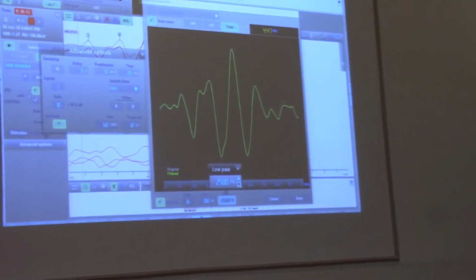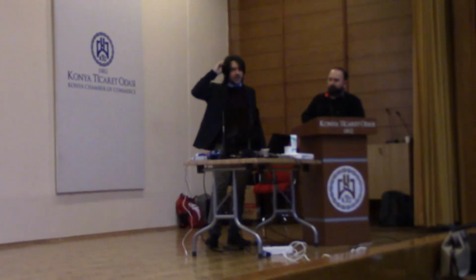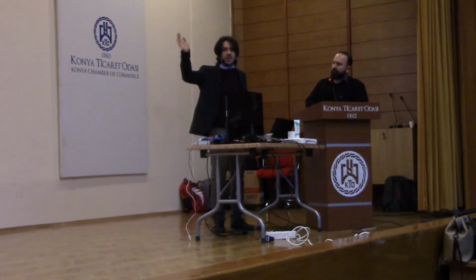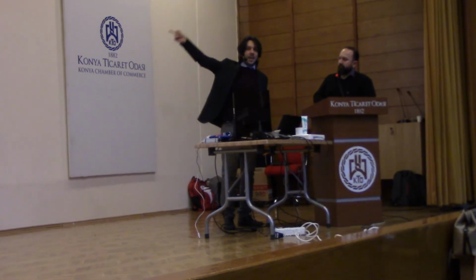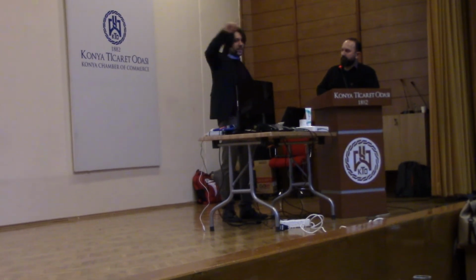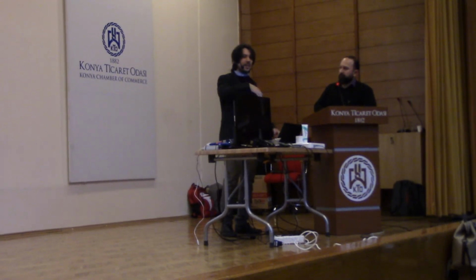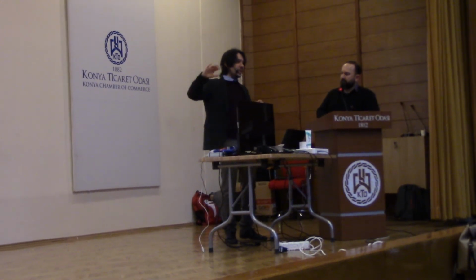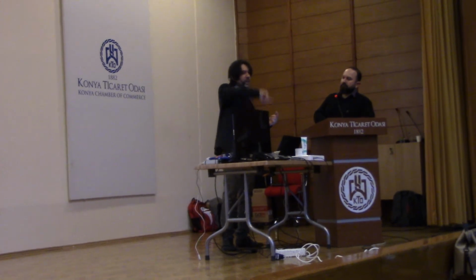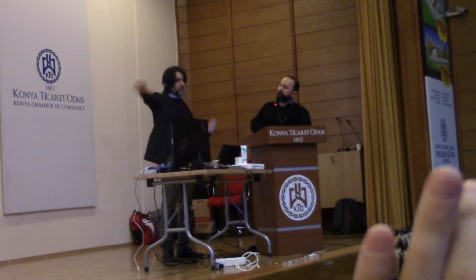So generally we use huge bands of filters. In some papers it's written 4,000, 6,000 hertz. Okay, consider that you have a low pass, okay, and a high pass. The low pass, the term says, I let the low frequencies come in, and the high are rejected. So this is the low pass. The high pass is I remove whatever is before, and I accept whatever is over.